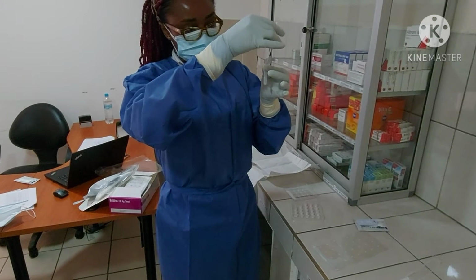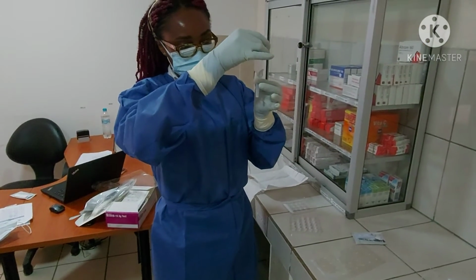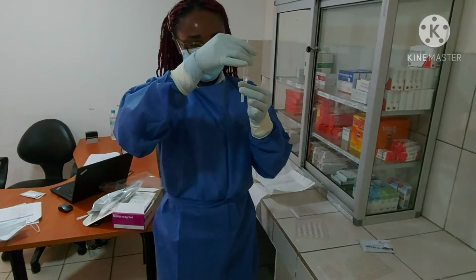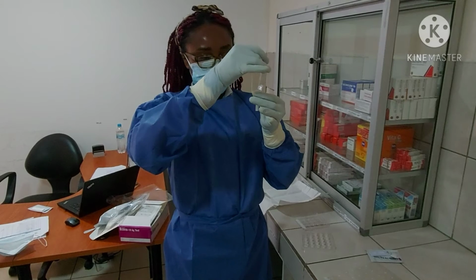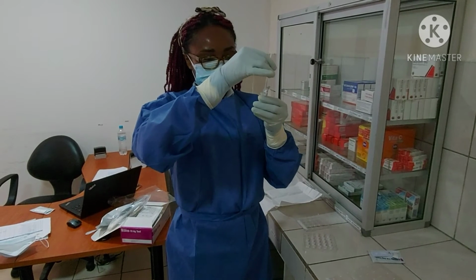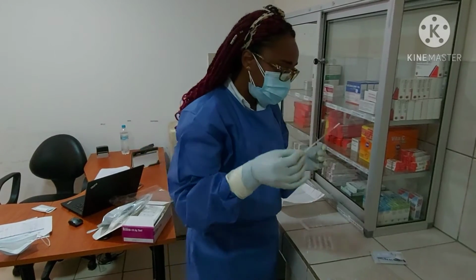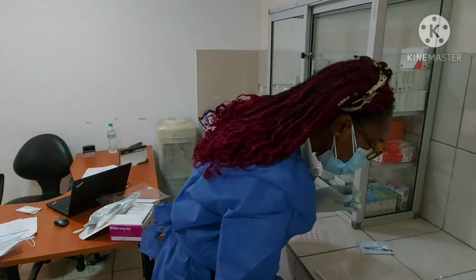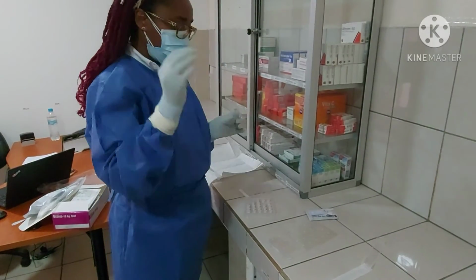Now that sample we've gotten in the nasal swab, we are introducing it into this container. This container has a liquid reagent, so we're putting the nasal swab into this liquid so that we can absorb the sample that we've collected from the nasal cavity. Once that is done, we're going to keep the nasal swab and then get the top.